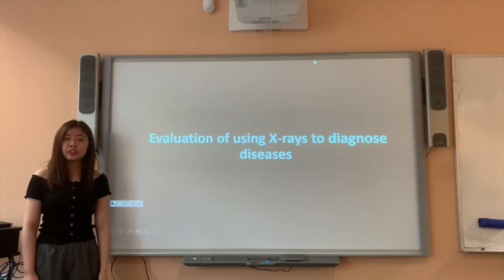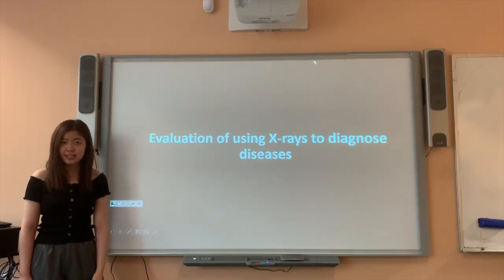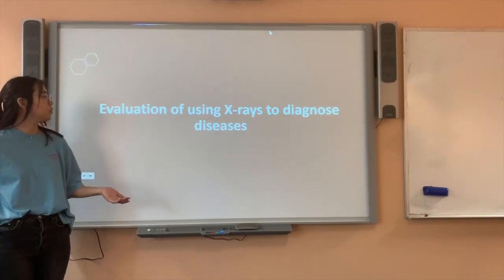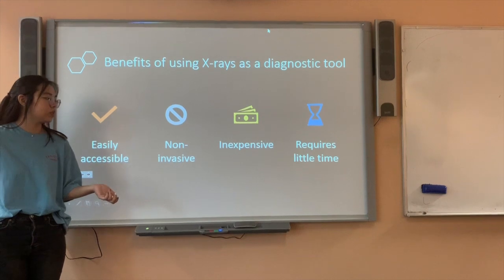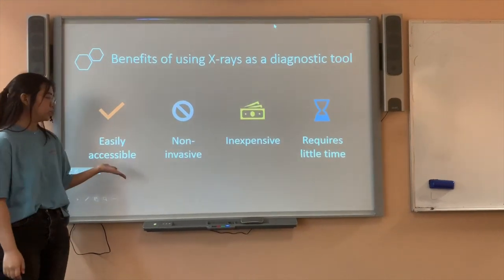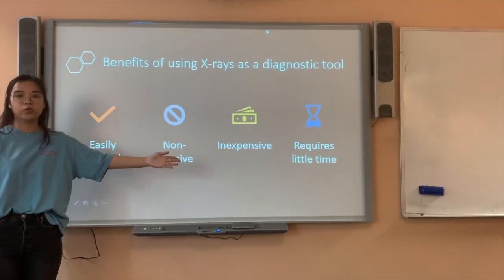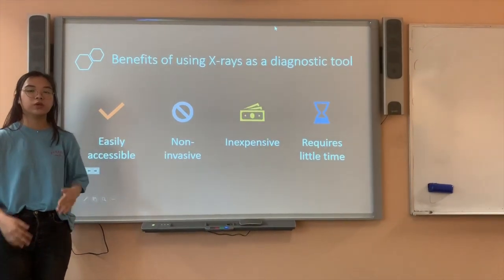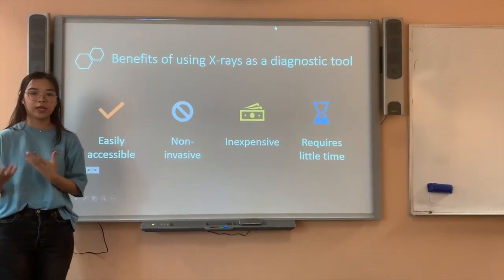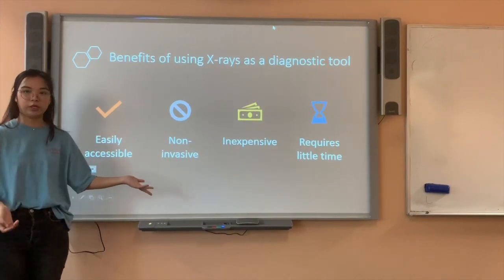Now we are going to talk about the evaluation of using an X-ray to diagnose a disease. I'll be talking about the benefits of using X-rays as a diagnostic tool. The reasons we use X-rays are that it's easily accessible, non-invasive, inexpensive, and requires little time. For example, in an emergency situation, doctors can ask for an X-ray to be taken of the patient relatively quickly, as it does not require much time.